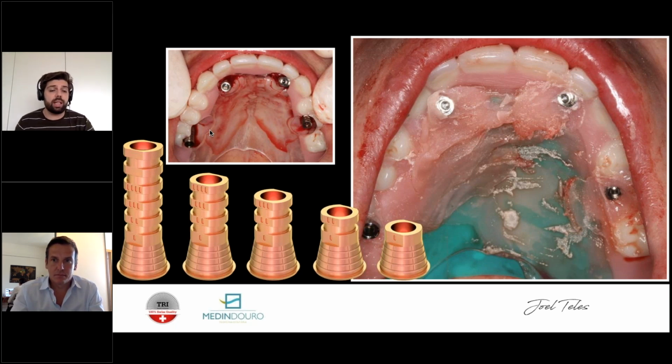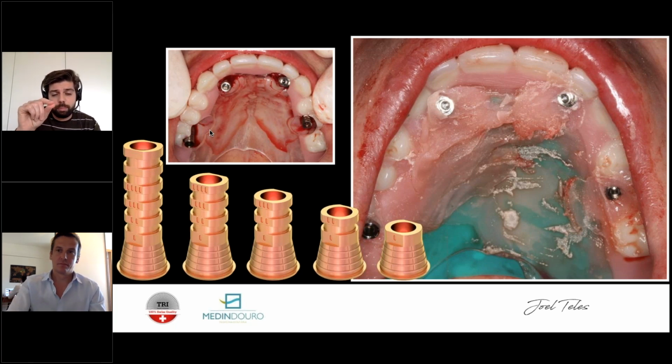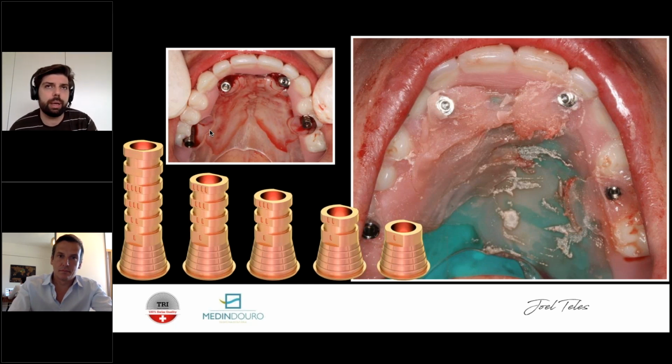But yeah, in the past I've harmed it and it bled, and I made some pressure on it with articaine anesthetic as well, and after a while it stopped. It's kind of stressful once you do, and all of a sudden your mouth is full with blood. I've been there, and sometimes big squirts of blood came out of the patient's mouth. But if you're careful enough, for many years I haven't touched it, even with very big flaps. Go around it, be safe.